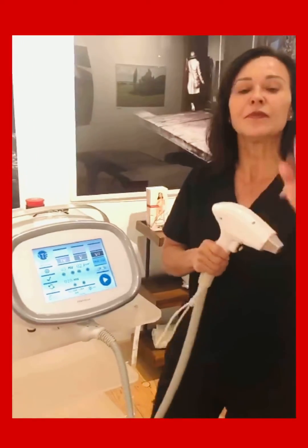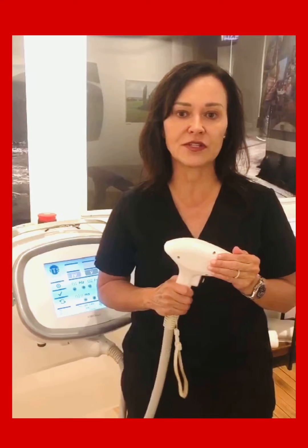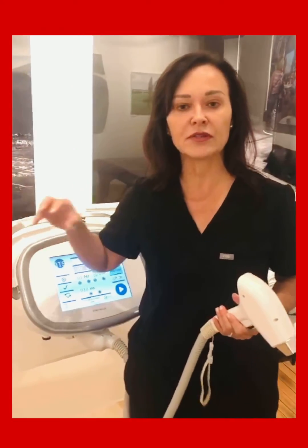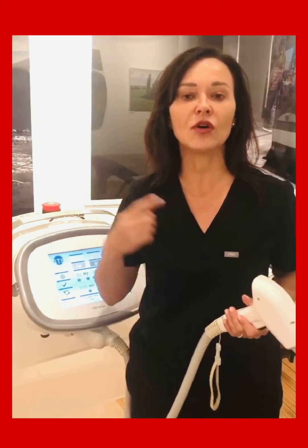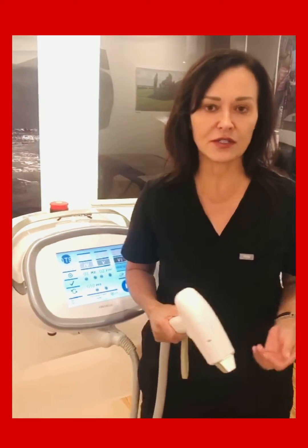Inside the handpiece there are two different cooling modes: one at zero degrees and one at five degrees Celsius. Because there are three internal cooling components built inside the system, you can run this all day long — eight, ten hours a day — without it shutting down or needing to cool off.